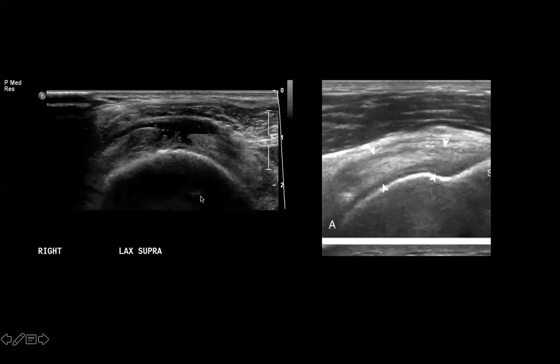Coming back to our image: compared to the normal, we can see a full thickness rotator cuff tear with a complete anechoic defect extending from the articular surface all the way to the bursal surface — from the humeral head to the peribursal fat. We do not see that anechoic defect in the normal image. Also illustrated here is a very important sign called the cartilage interface sign.